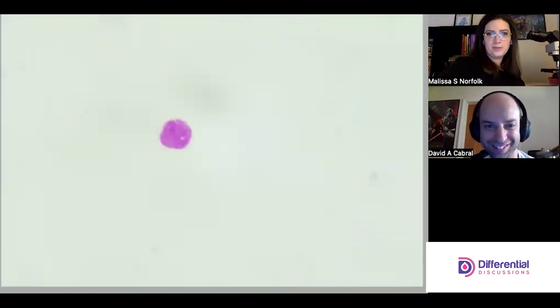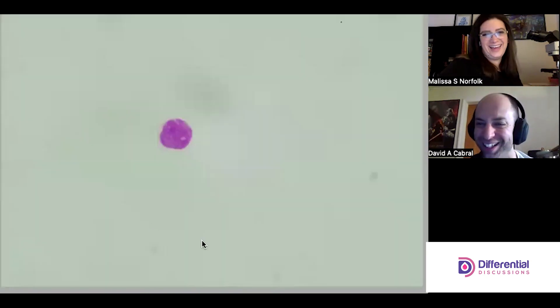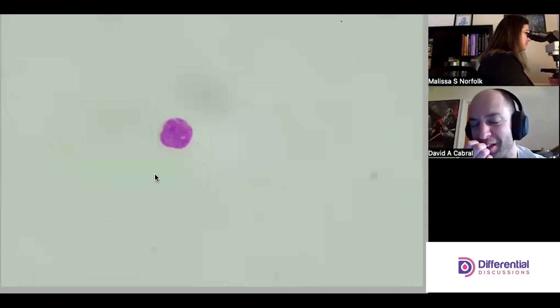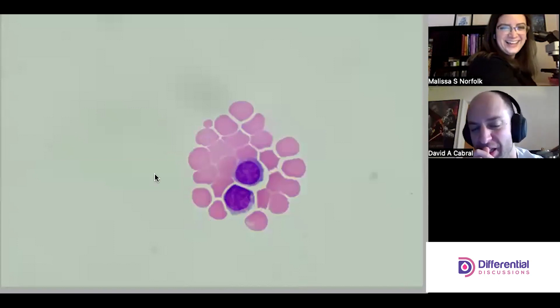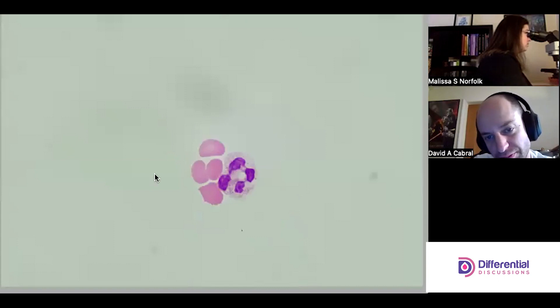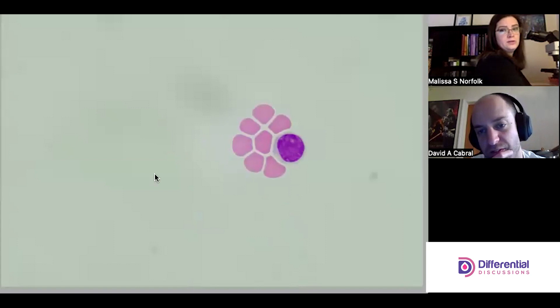Let's look around. Oh baby. So I think I'm gonna have to lower the light a little bit. Cytoplasm's there now but it was gone when the light was that high. Some of the slides are probably getting a little old too, huh? Oh there we go, oh cool, much better. We got some lymphocytes hanging out with red cells, a nice neutrophil, beautiful. Another lymph.